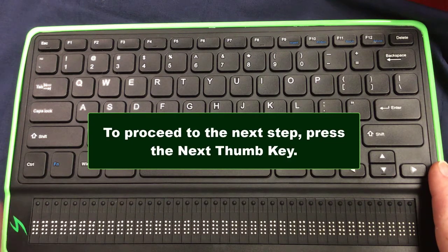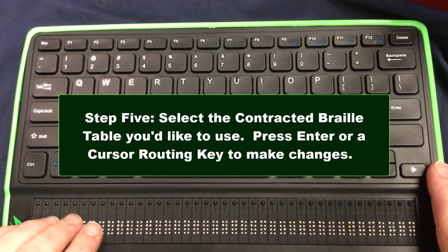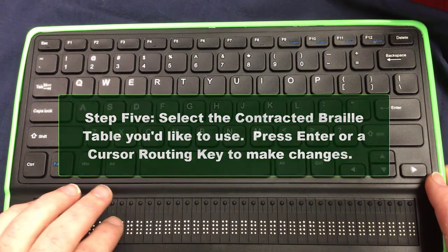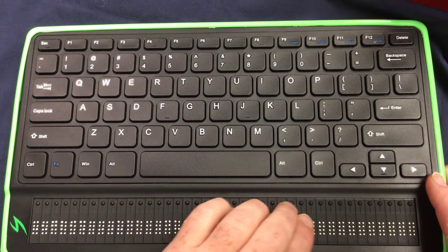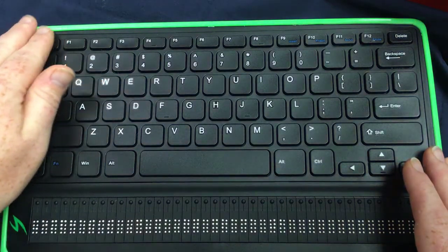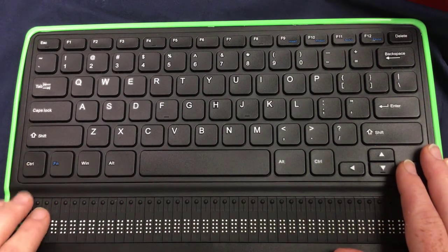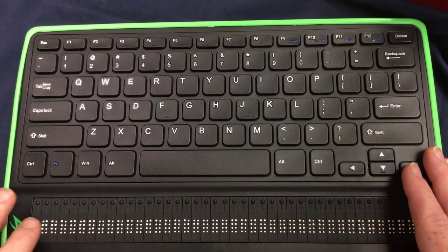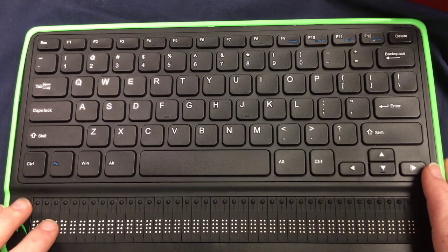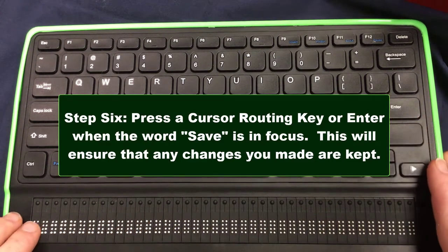I'll press a cursor routing key to select English UEB for the contracted braille table. Now going past that, I see 'save.' I'll press a cursor routing key to save this. It says save — great. Now reviewing my options, I have the contracted UEB which is still the default braille profile from before.